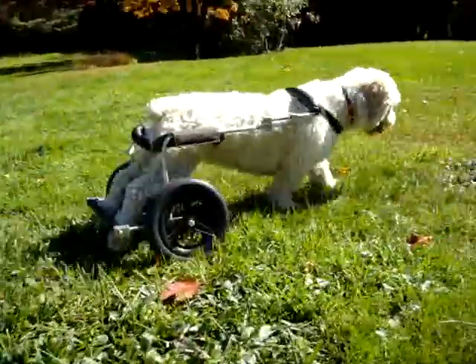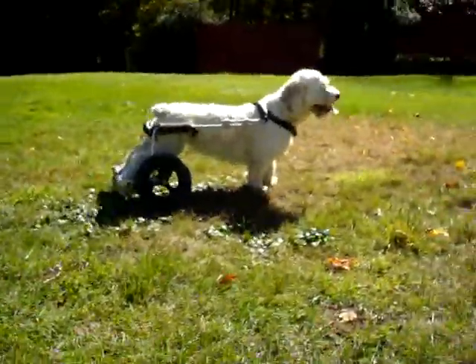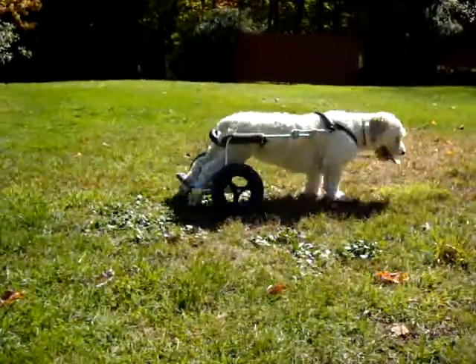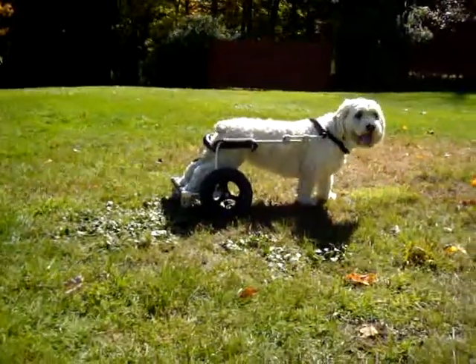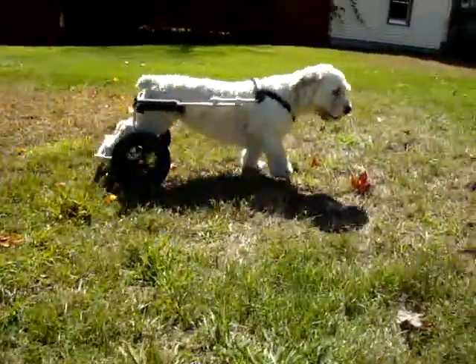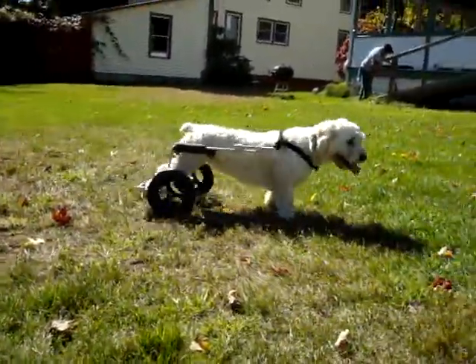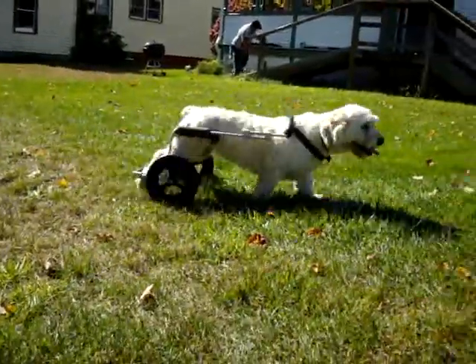Go, Chloe! Go, Chloe! Go, Chloe! Here you go. Good job. Such a handsome girl. Come on, Chloe. Come on — she needs someone to play with. Sweet pea, sweet pea. Come on, come on.